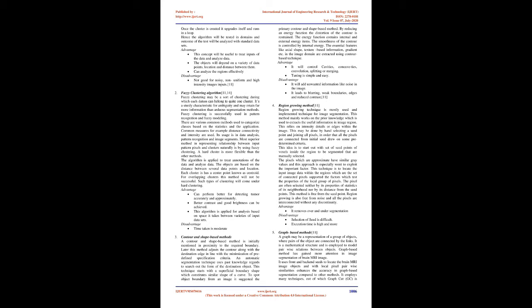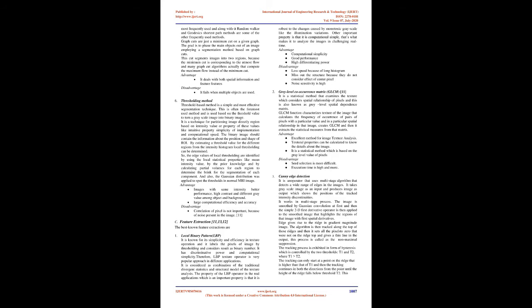Disadvantage. Time taken is moderate. 3. Contour and shape-based methods. A contour and shape-based method is initially placed in proximity to the required boundary. Later this method adjusts the contour along with the destination edge in line with the minimization of predefined specification criteria.